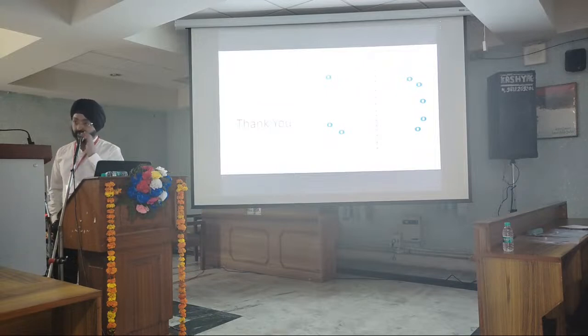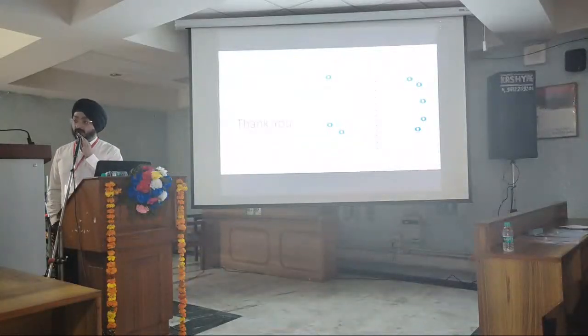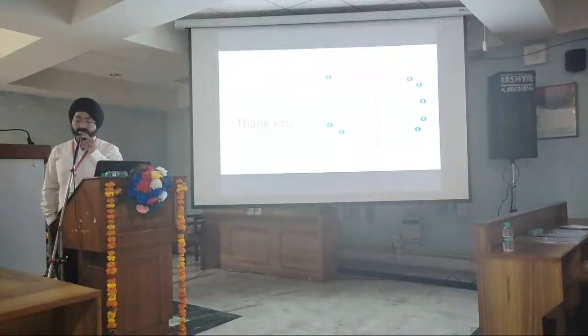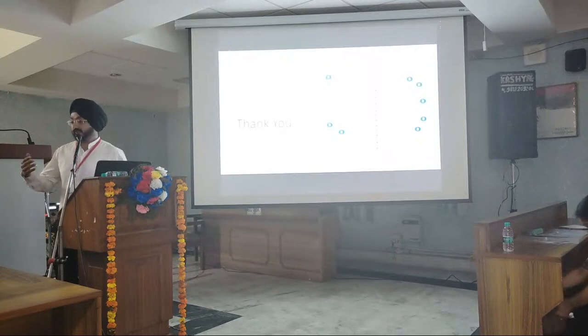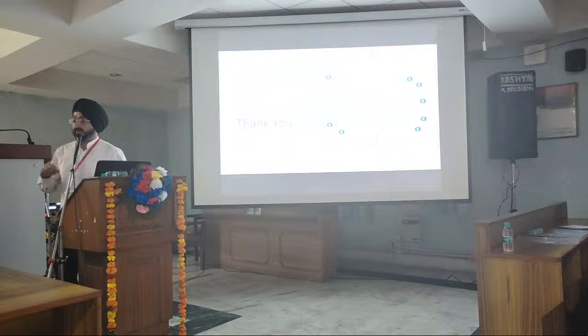Sir, we have experience over the last 5-10 years, and right now one of the most common indications for which we are getting these scans is for initial diagnosis only, and we do biopsies also in those cases. A couple of years back there was no consensus. We used to say it is useful, but most people used to say it is not useful. But after that, more and more studies have come, and the PRIMARY trial has concluded, which has shown that overall it improves the detection rate to more than 90%, and it is better.